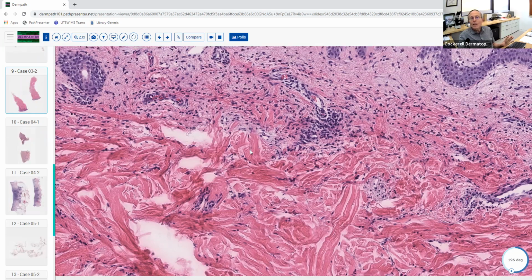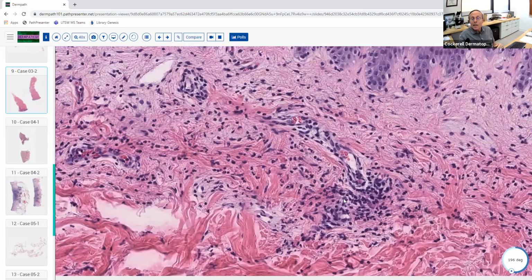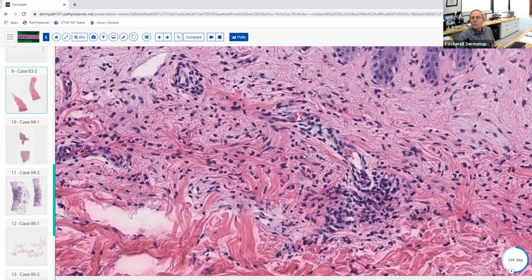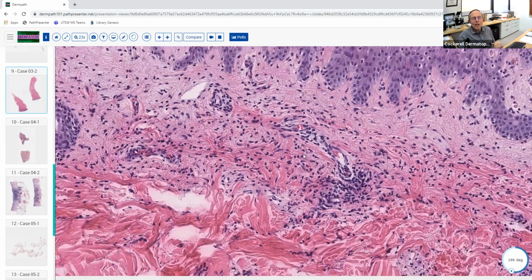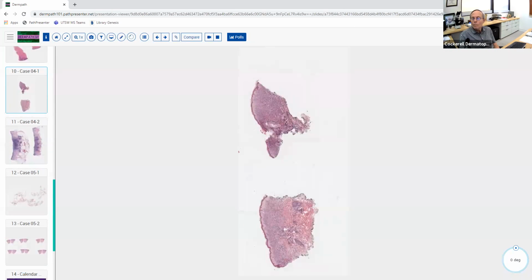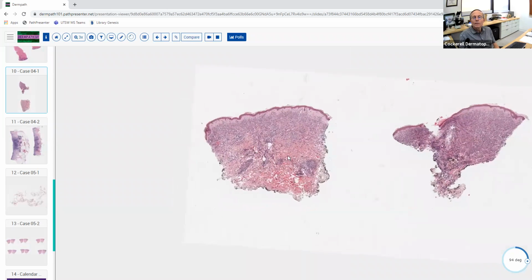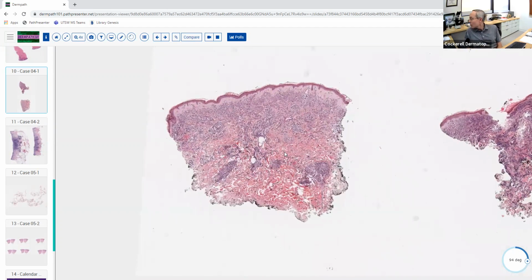Okay, and this is what you see in the autoinflammatory diseases, like adult Still's disease, and things like that. So this is an urticarial process. It's got mostly neutrophils in this case. So that's in contrast to the last one. Okay, this is one you guys ought to get here also, or at least should hopefully get into the right category.